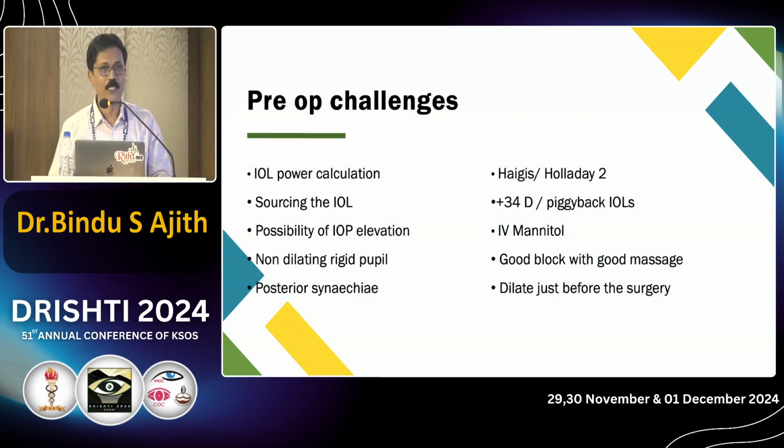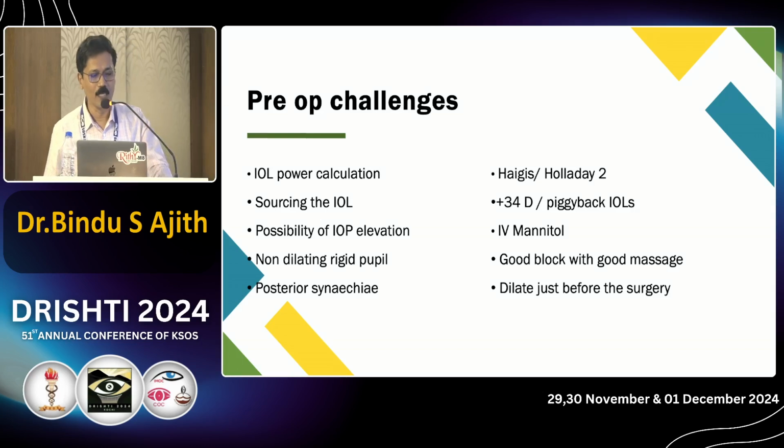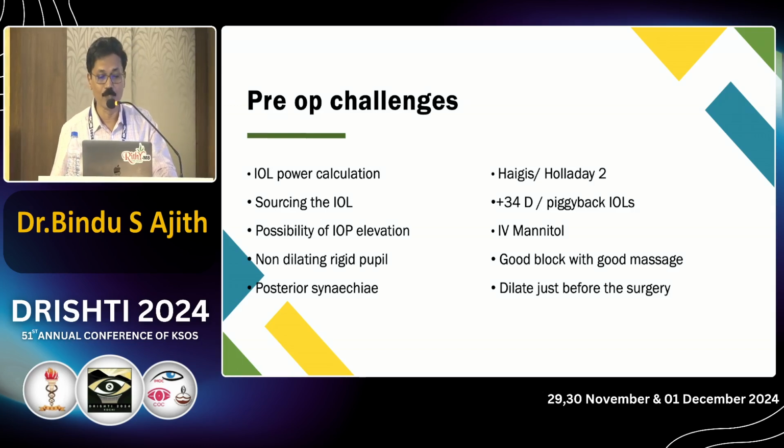There is a possibility of the intraocular pressure elevating during the surgery also. So in all of these patients, invariably, I always start IV mannitol unless there is any medical contraindication. In some cases, you may need to give a block also with a good massage. And one important point is we have to dilate the patient just before the surgery. If you have a big list, you should not dilate the patient right in the morning and do it as the last case.